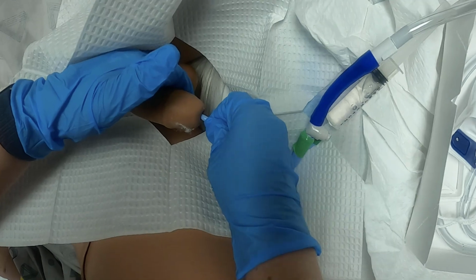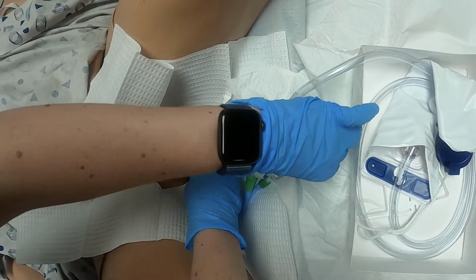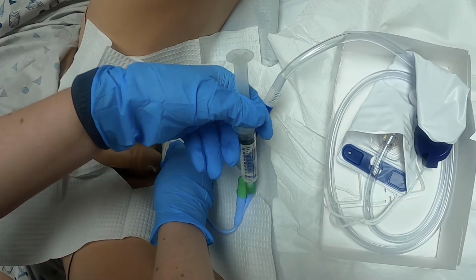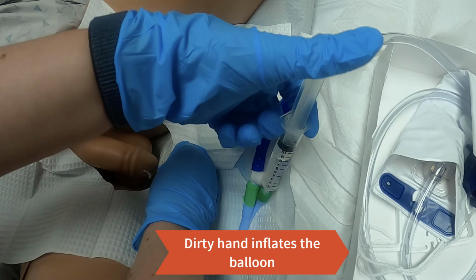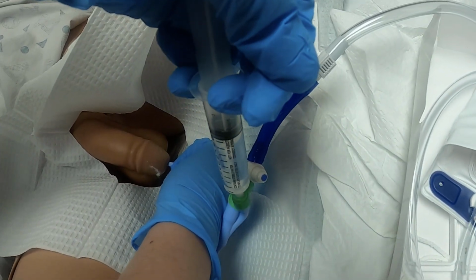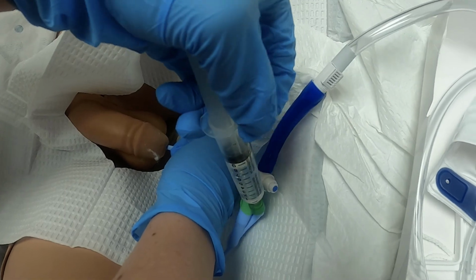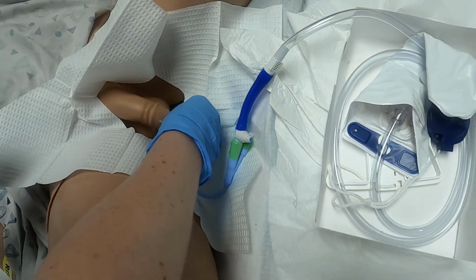With the hand that was holding the penis, you're gonna let go and inflate your balloon with the 10 cc's, okay? Inflate it all the way. And then you go ahead and detach it. Okay.